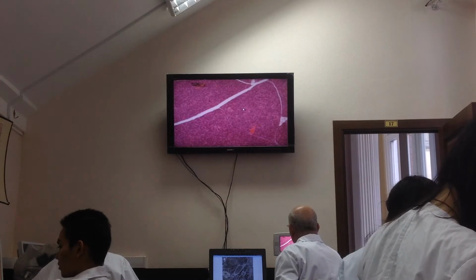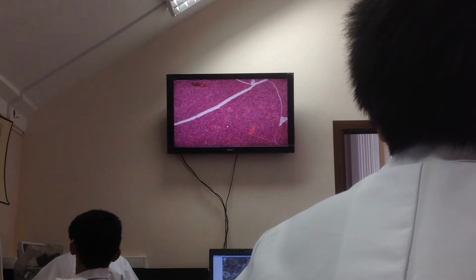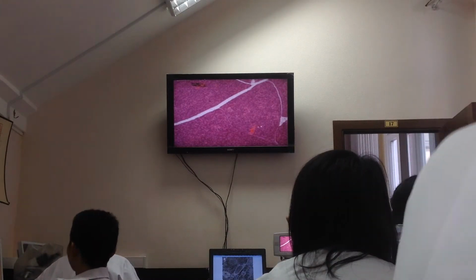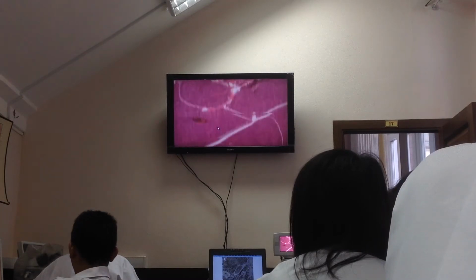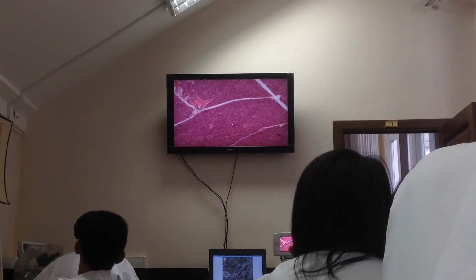Look, low magnification. See? Regions in the lobules, you see small regions, less colored. And these regions contain compact groups of cells that correspond to pancreatic islets. It's endocrine structures. Look. What is this? See? What is this?